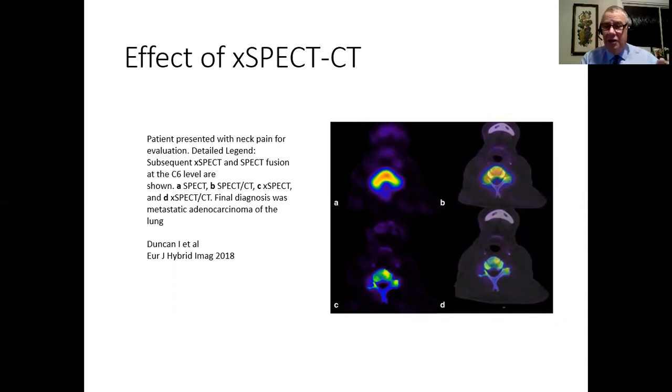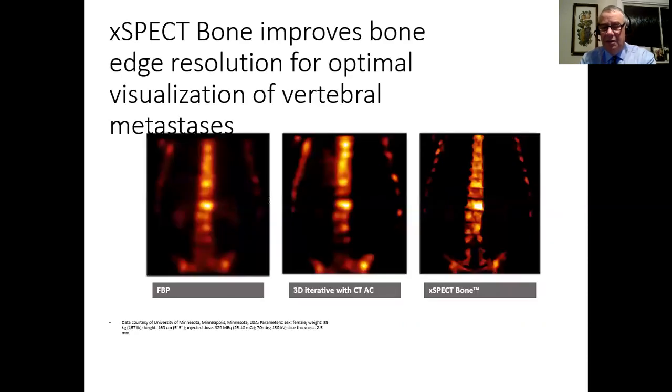This is all very, very new. I mean, you may have one of these machines. As I said, we just got one going through, it's been accepted at my hospital. But I think it's an exciting new area, particularly in sort of orthopedic type of situations. So again, this is provided for me from the Siemens company that makes this particular program.